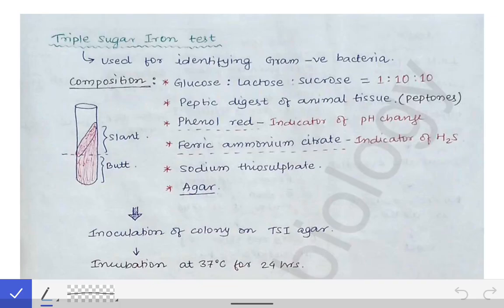So, in our last lecture, we discussed the different methods of culture identification, where I had classified the culture identification methods into two divisions. One was the conventional methods of culture identification, and the other one was the automated systems or methods.